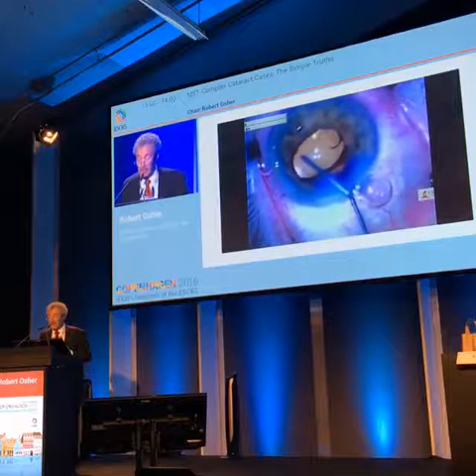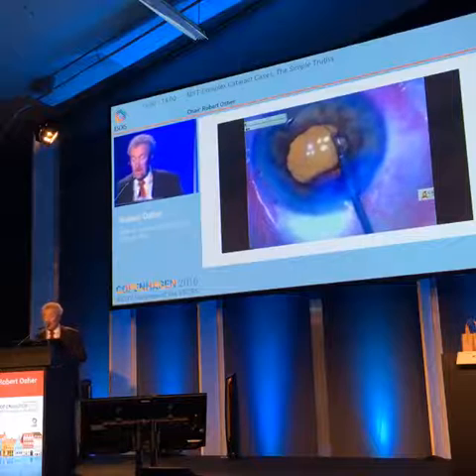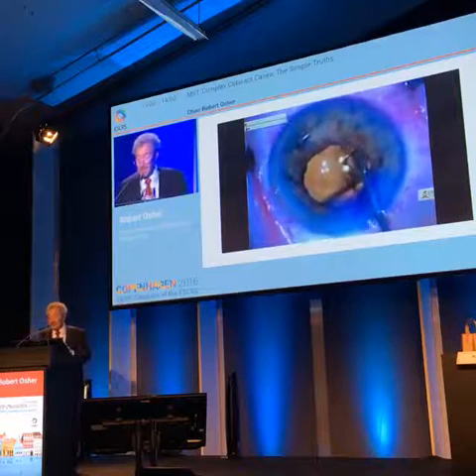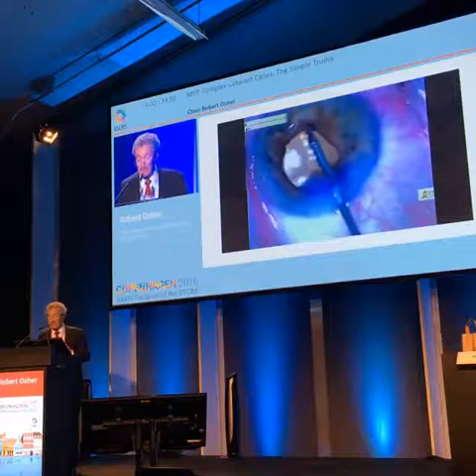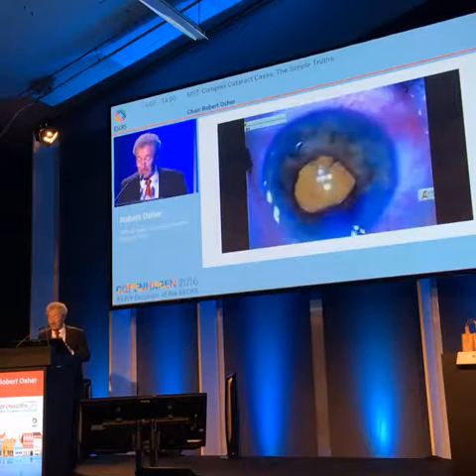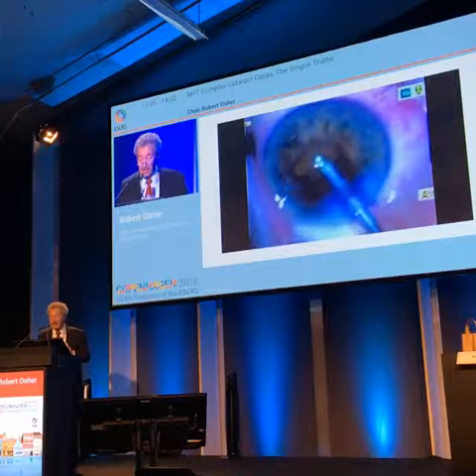And then I've got the synechiae from the angle closure. And I'm going to do a peripupillary membranectomy. And this is where I kind of become hypoglycemic and I make a mistake. But you'll see the mistake in a moment. I love stripping the pupil. The pupil will dilate so nicely. See the Flomax? Look at that. See that?